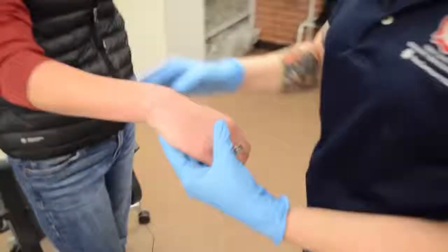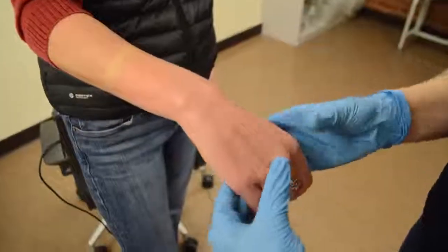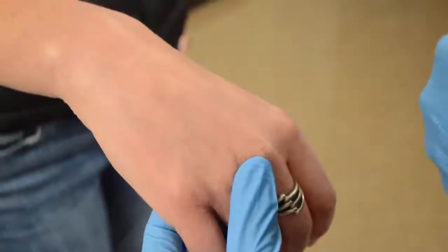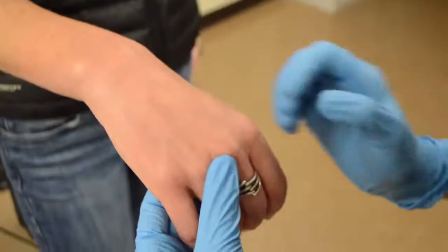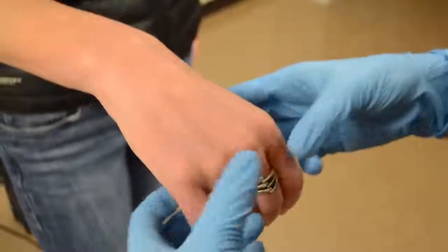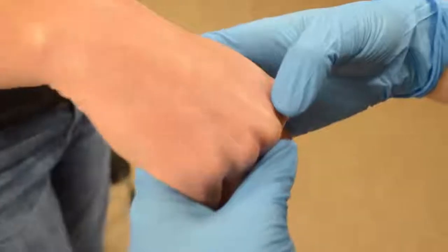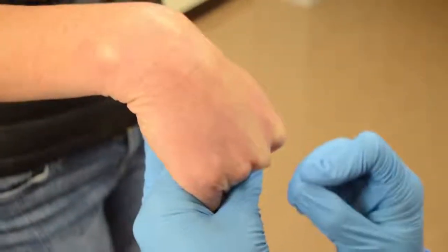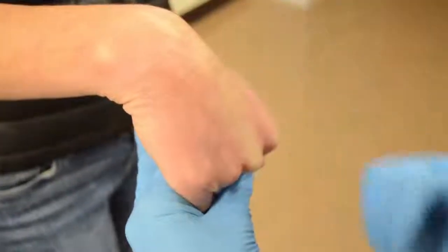When you have a hand, you want to start your tourniquet usually down here, not too close, just a little bit further away. Now, hand veins are very superficial. You don't need to go at a very steep angle to find your vein. Also, they're bony and they have a lot of nerve endings in them, so it's more painful for the patient. There are a few ways you can hold the hand. You can either have the patient just hold your hand like this, or you can curl the hand under. And it's always a good idea to angle down so that you can come up at the vein straighter and on the same plane as the hand itself.